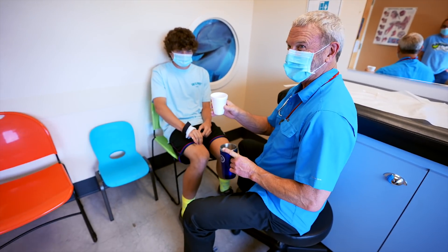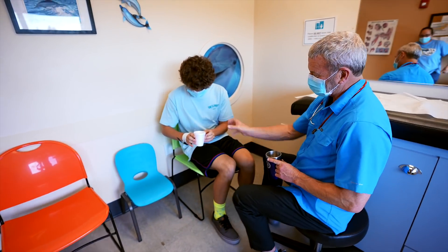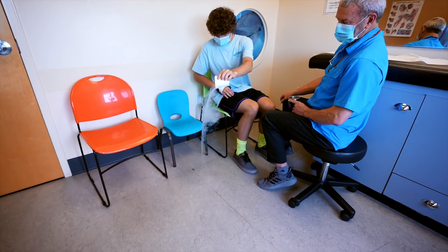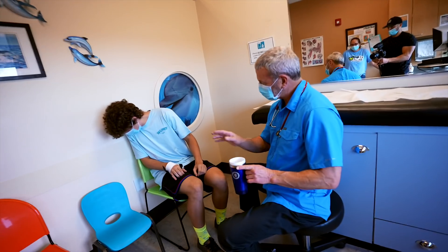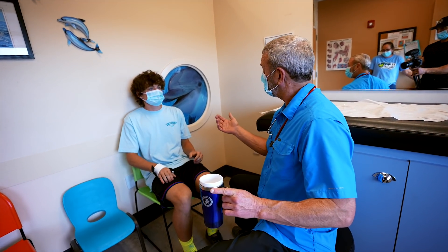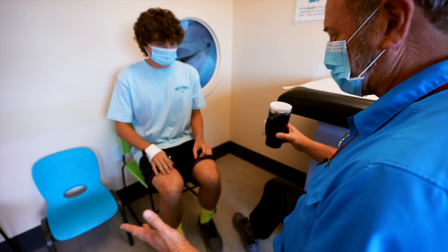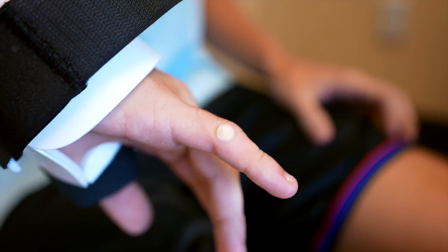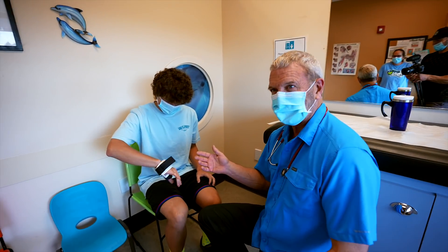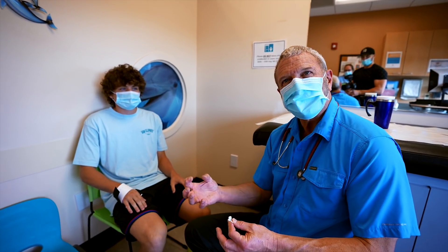And I put extra in for you, so this is going to be really cool — you get to dump this on the floor. Just pour it hard. Isn't that cool? It is so cool. And if your wart doesn't go away in a month, you can come back and we'll do it again. Now your thumb has a friend — you got pain on both sides. The worst of the pain is for five or ten minutes, and then it's just a little dull ache for a day or two. You can ignore it — it just sort of shrinks away.